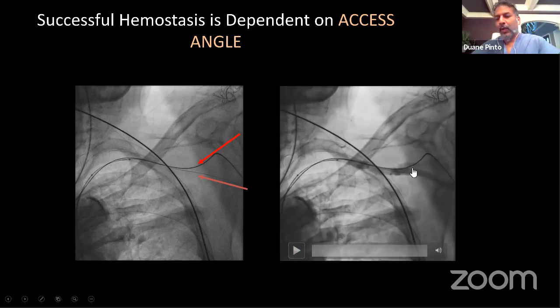And again, if your wire is actually tenting the artery, there can also be bleeding with a very sharp angle like this, which you can see in this angiogram, but which is also helpful to show you that if there is bleeding and you're in the second portion of the axillary artery, it's not going to be in the thorax. It's going to be out here.